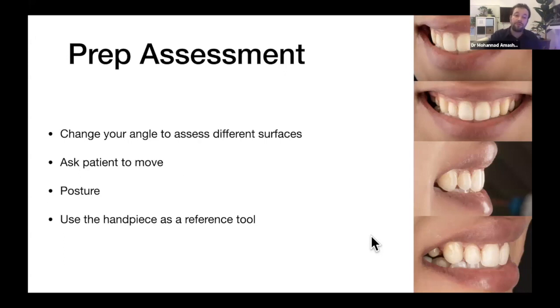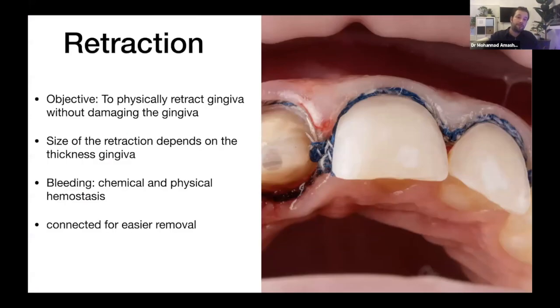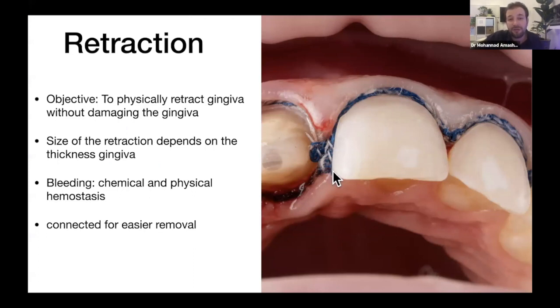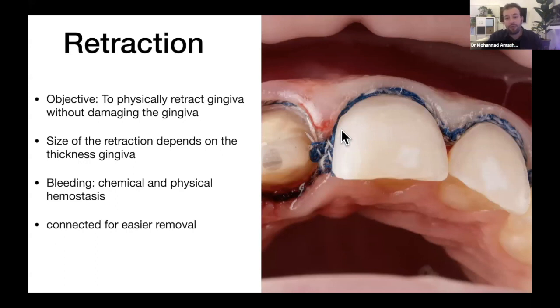That's everything about preparation. Now let's talk about impressions. The most important step is the retraction. Our objective is to physically move the gingiva away from the preparation without damaging it in the process. Tuck it gently — it doesn't require a lot of force. Controlled, gentle force will help you avoid bleeding.